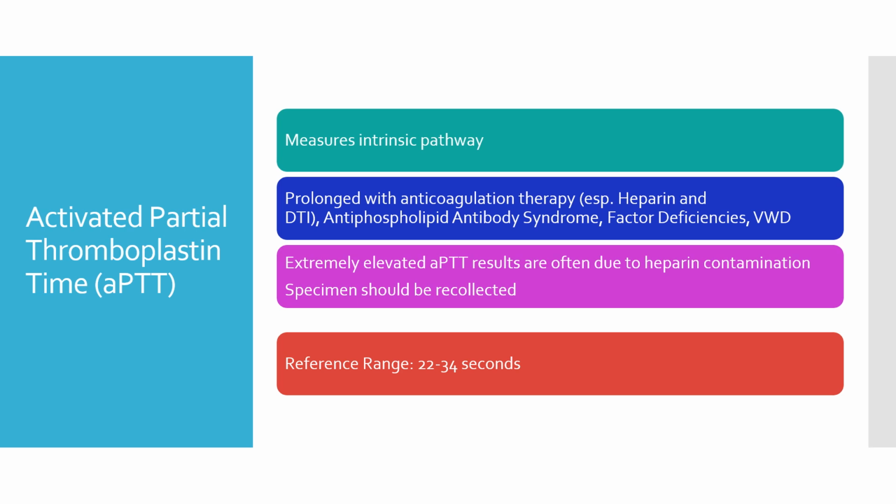So most inpatients who are receiving heparin while they're here in the hospital are given unfractionated heparin through their IV. And oftentimes nurses will draw blood samples for testing out of the IV. And it's very, very important for them to stop the heparin drip, flush the line, waste a sample, and then collect if at all possible, because we don't need that heparin contaminating the sample. It does happen very frequently, though. Very rarely do we actually see an overheparinized patient, although it does happen.